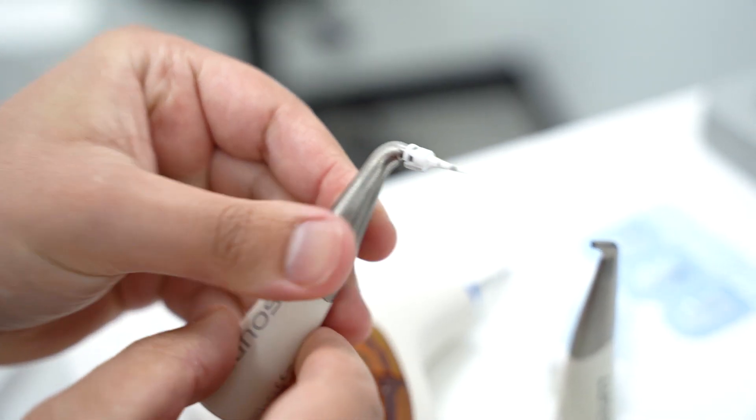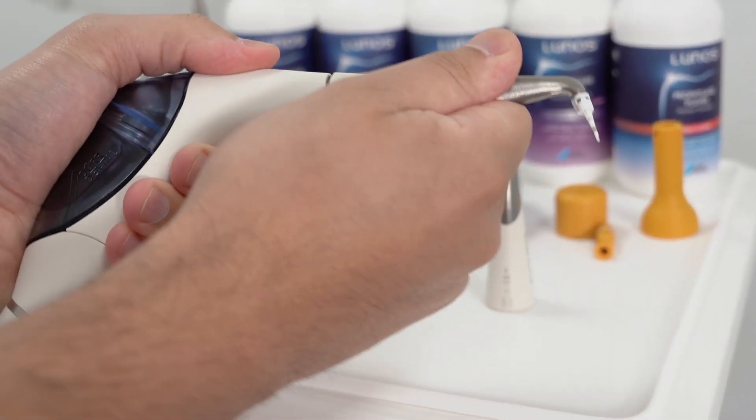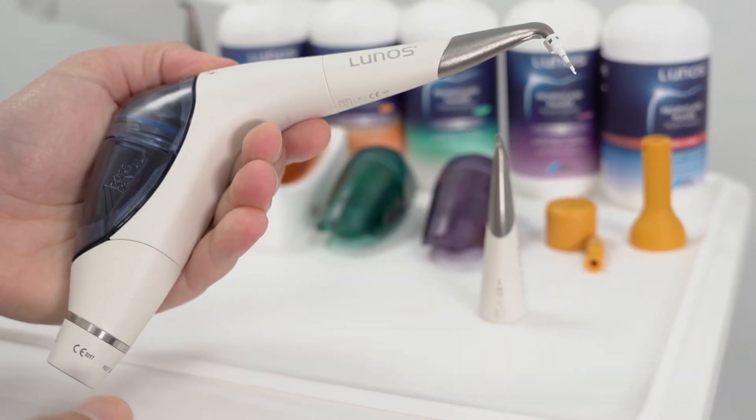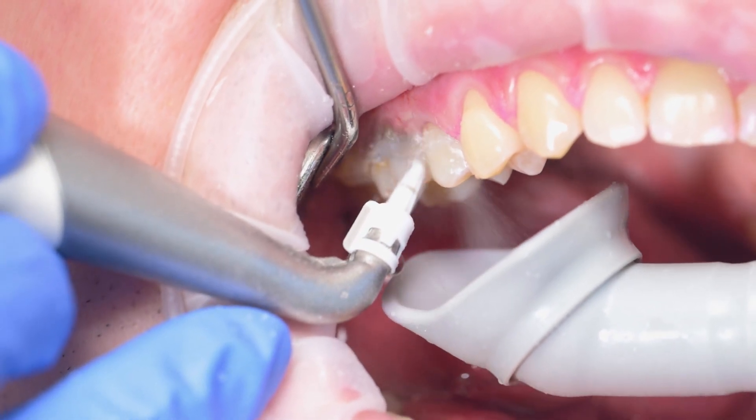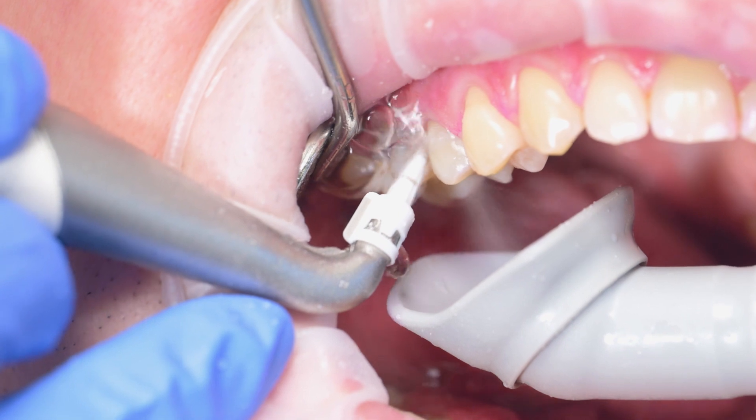The grey guidance line allows for easy insertion onto the perio nozzle. With clearly marked depth measurements and a single lateral opening, you can be confident to control the insertion depth and reduce the risk of air embolisms.